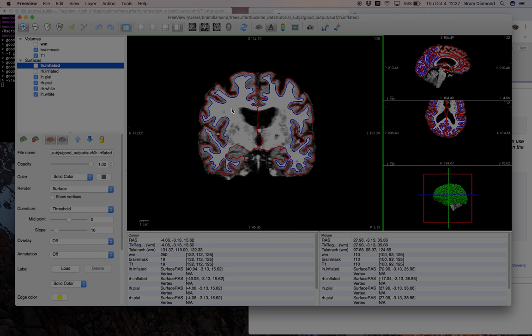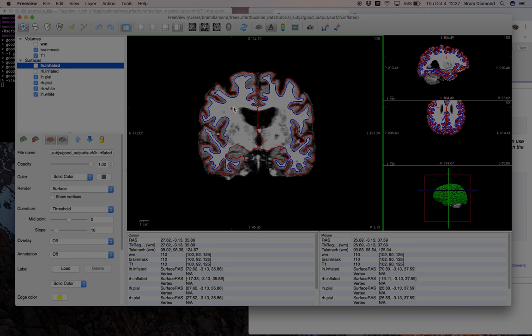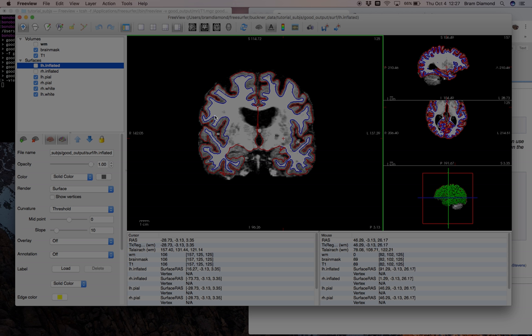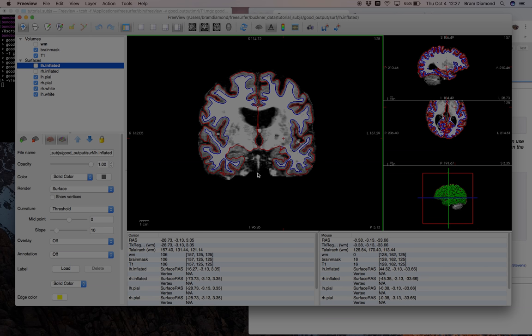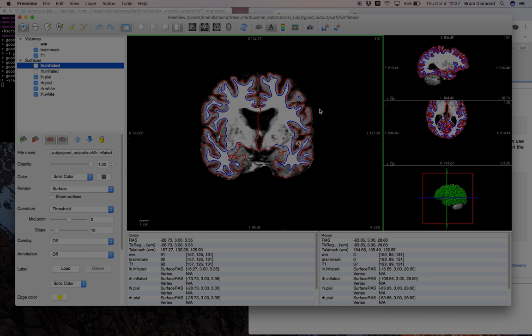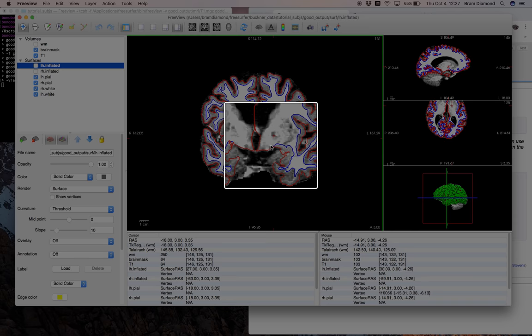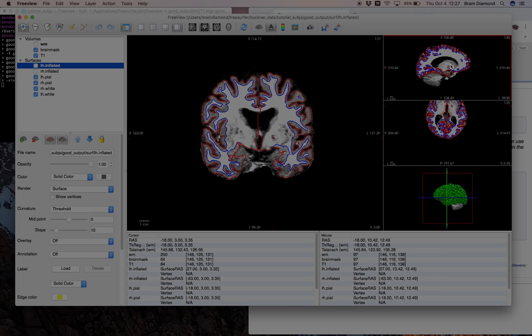You can set the red crosshairs by left-clicking on the brain, and you can get information about that location in the information panel. The highlighted box indicates the orientation you will scroll through using the up and down arrows — currently the coronal orientation highlighted in green. If you highlight a different orientation, such as the sagittal view, pressing up and down will scroll through that view, and the crosshair will move left to right through the brain.